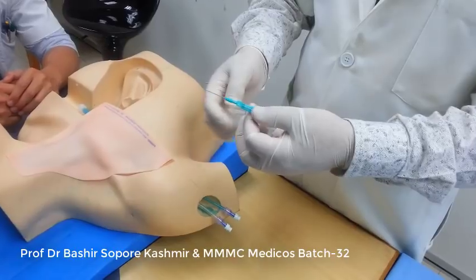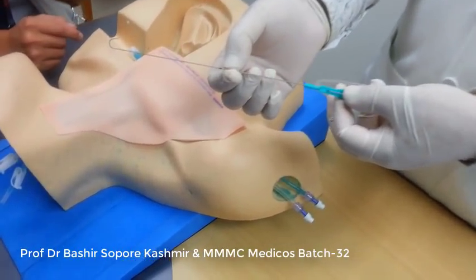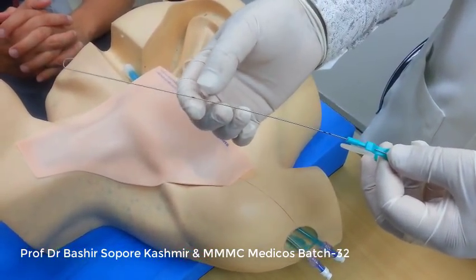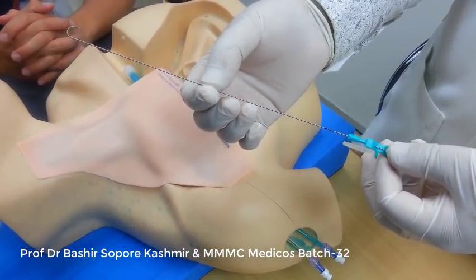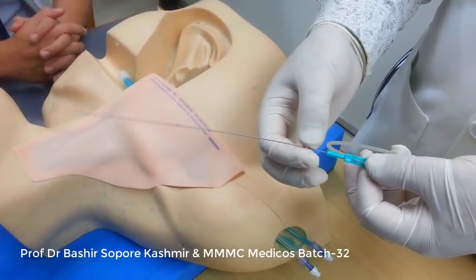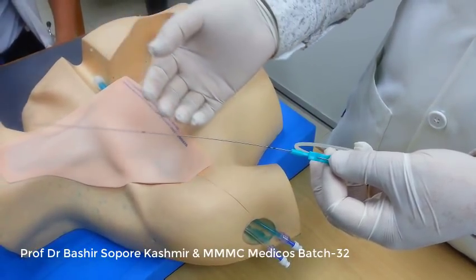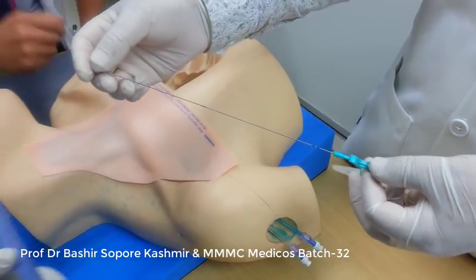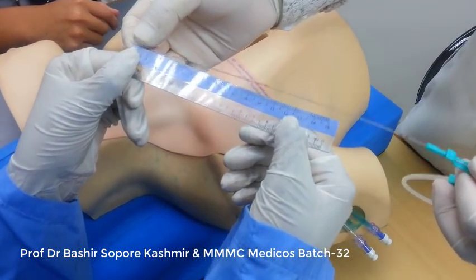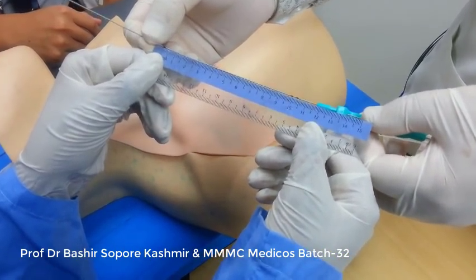Now this guide wire also has some markings. You see, the markings are there on the guide wire. You got my point? The first marking should be around 10 centimeters. You can check. Anybody has a scale? Yes. See, you can measure it. See how much it is on the scale. First, this one. How many centimeters? 10 centimeters. The second? Another 10.